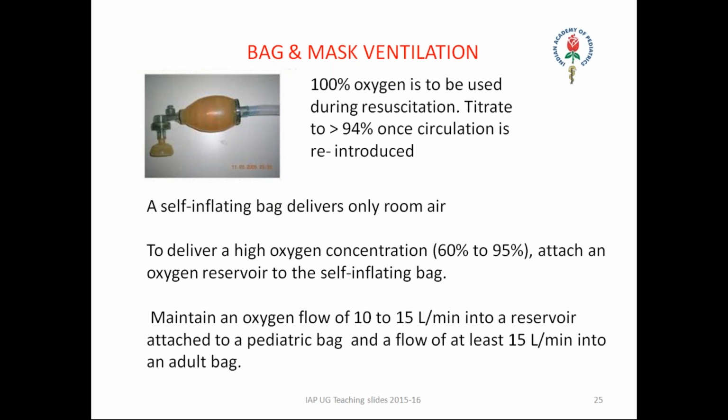A self-inflating bag, if it is not connected to anything, delivers only room air, that is 21%. You can also have two types of reservoirs, an open-end reservoir and a closed-end reservoir. If nothing is connected and only room air is used, you get 21% oxygen. To deliver a high oxygen concentration, 60 to 95%, attach an oxygen reservoir to the self-inflating bag. Here it is with the reservoir. So it gives about 60%.